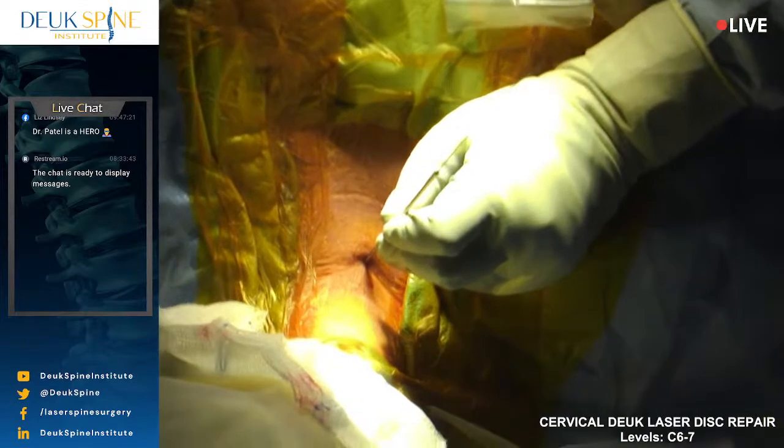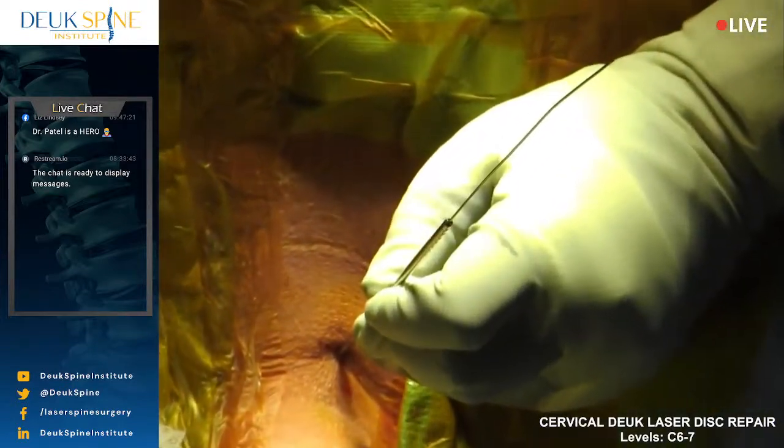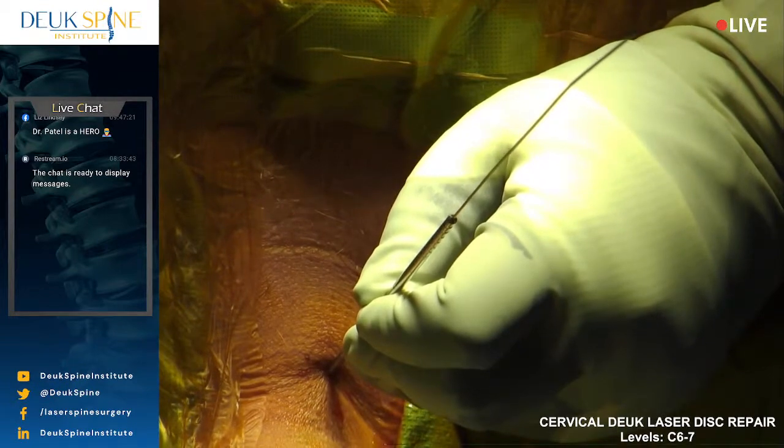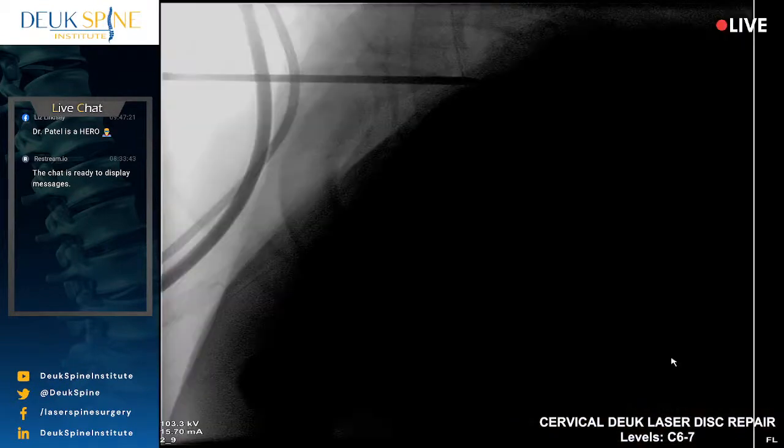All right, so we're gonna need, where are you getting? Oh, I need the other needle because after you. Let's get an AP. I don't know what you're saying. You want a discogram after that, right? I want to do a discogram. Yeah, so we need the other skinny needle. Yes, yeah. All right, so you're saying the other one won't fit in here. Correct. Yeah. You want to hold that?